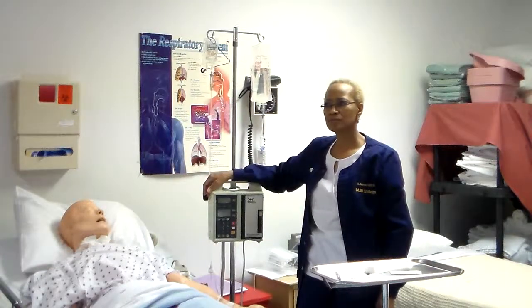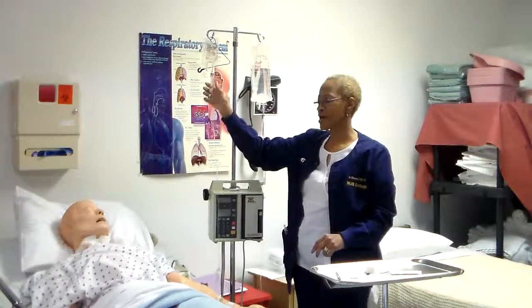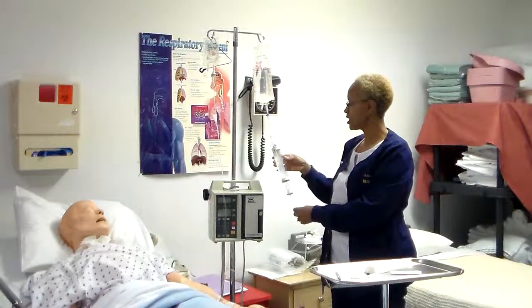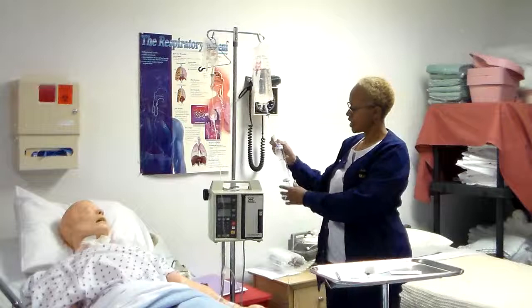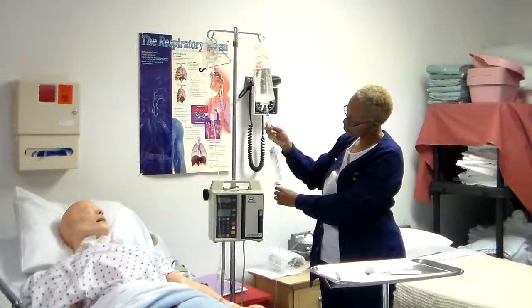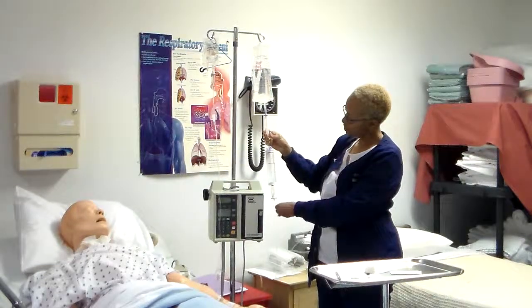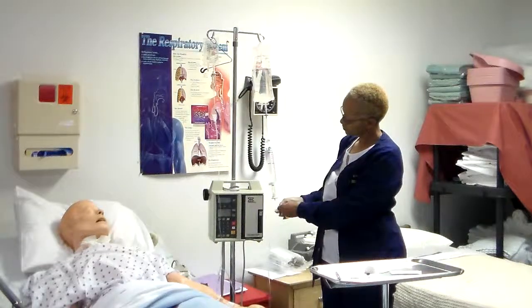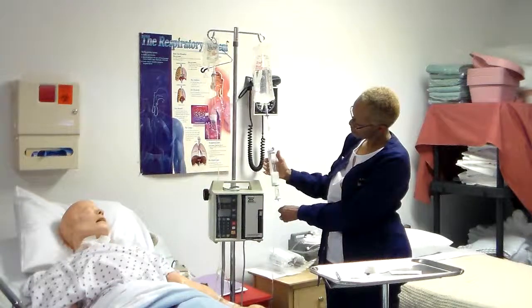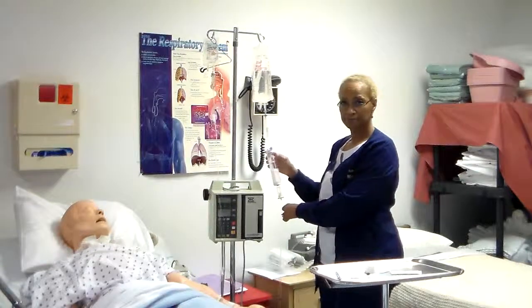Volume control administration set. Okay, so a second way, so this was by a piggyback. A second way that you can deliver a medication is you can add in the amount of volume that you need here in your Volutrol. So let's say I'm going to deliver this in 50. The doctor wants it in 50 mLs. Okay. I was squeezing, put 50 in here. Okay. Go ahead.